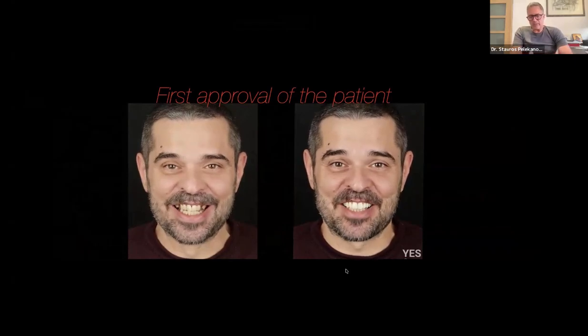We call it the Yes video. For those who want to learn a little bit about SmileCloud, in September we have it in Timisoara with Florin Kofar, a very nice event explaining all the features of treatment planning and SmileCloud. So this is like the first approval of the patient. These are just pictures in motion. It's not a video. So this is just for approval of the patient.